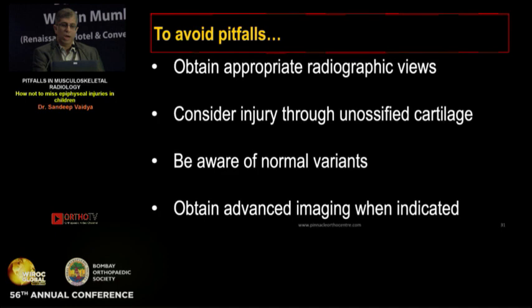So to conclude, again, I am enumerating what I discussed. Obtain appropriate radiographic views, consider injury through unossified cartilage, be aware of normal variants, and obtain advanced imaging when indicated.